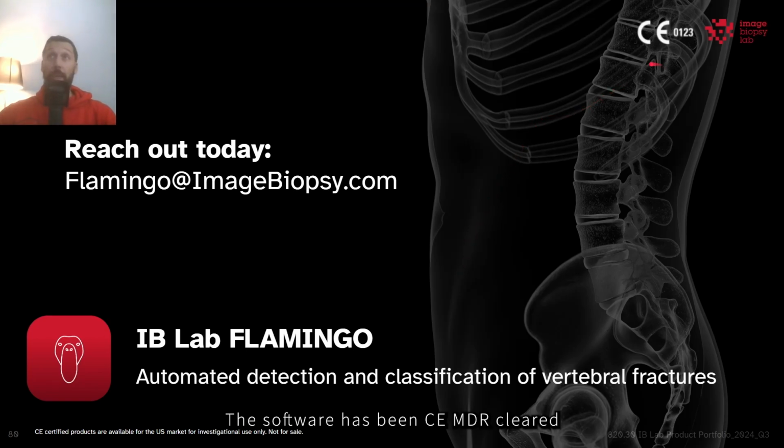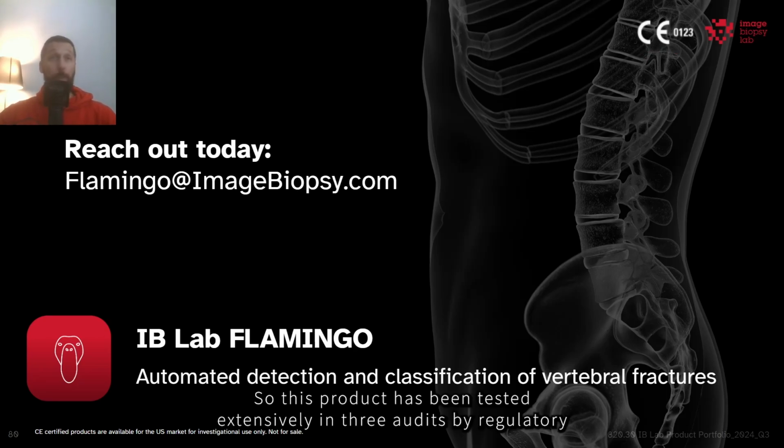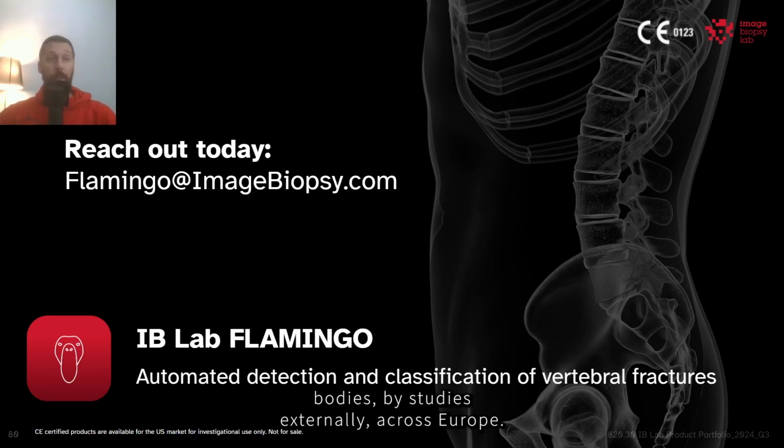The software has been CE MDR cleared by the reputable TÜV Süd in Germany, notified body. So this product has been tested extensively in 3 audits by regulatory bodies, by studies externally across Europe, and we are ready to improve your osteoporosis care pathway with this product.